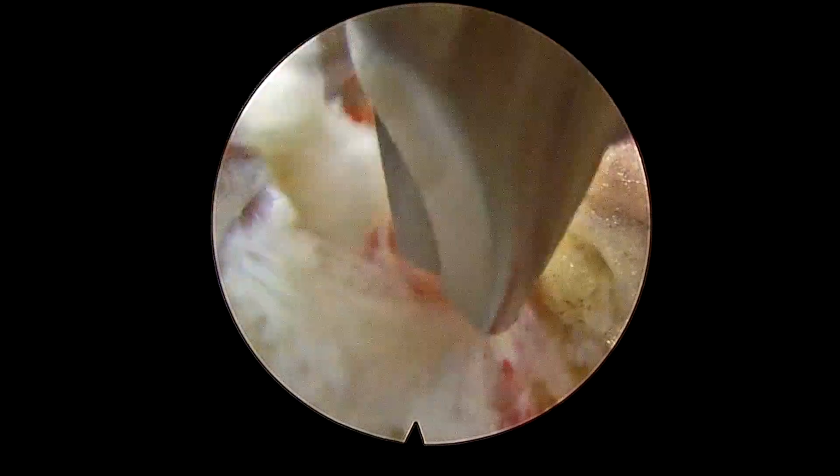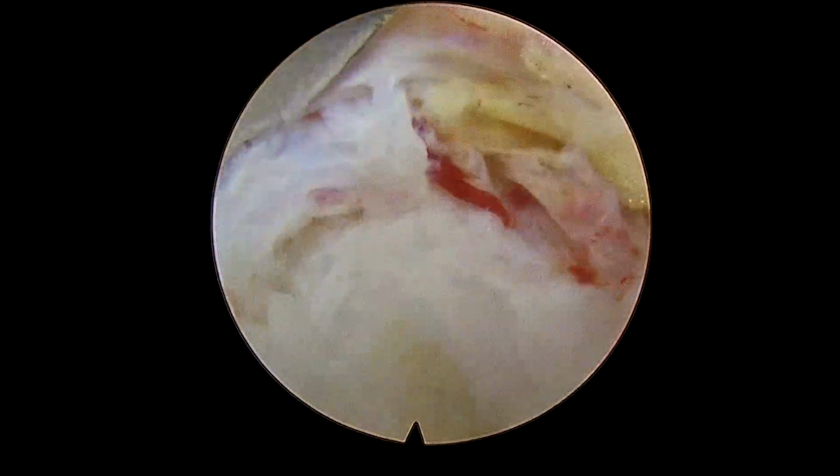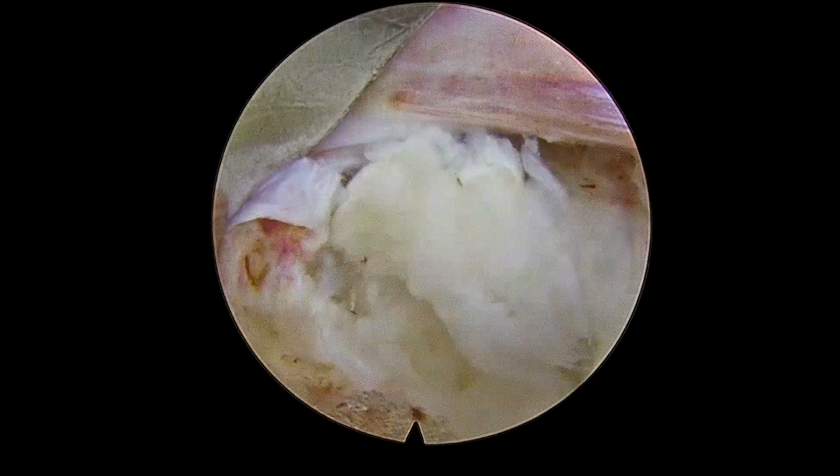This is nothing but the central annulus. So what I am removing now is the central annulus. I have retracted the nerve root till the midline. It is only possible with the help of the discoscope. You should not try this with the stenoscope, because the stenoscope has a larger diameter. You cannot retract your nerve root beyond the midline.